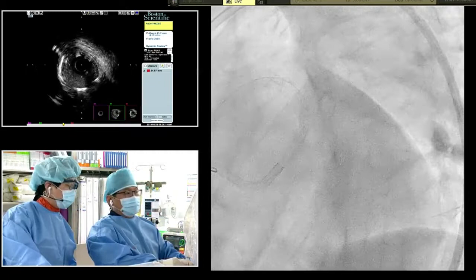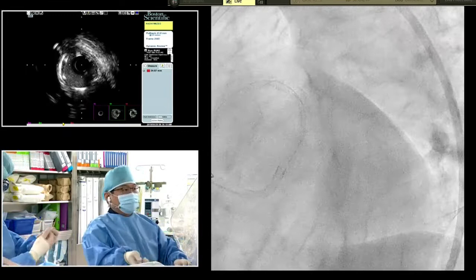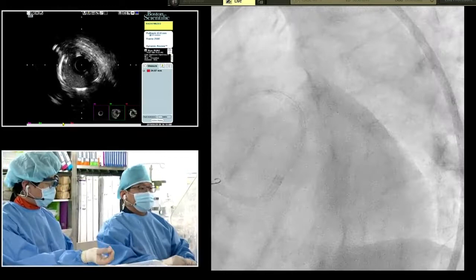That said, I think they have only limited tools. They have rotational atherectomy. They don't have laser or shockwave, so maybe it's not relevant. It's an interesting question theoretically, but they only have one tool. That's right. I'm a big fan of IVUS, but one look at the fluoroscopy tells you what the story is. That's a rock outside the left main.